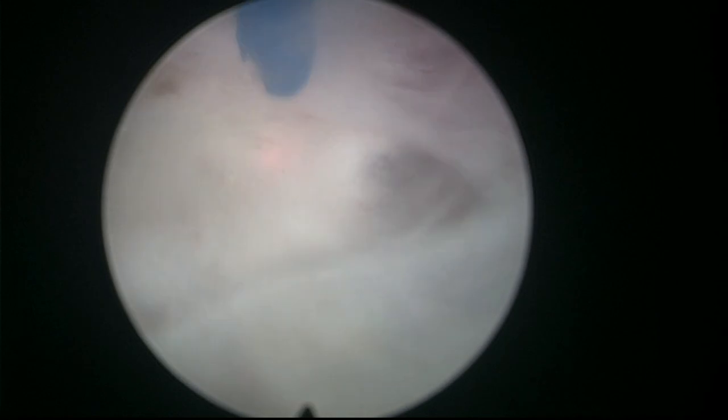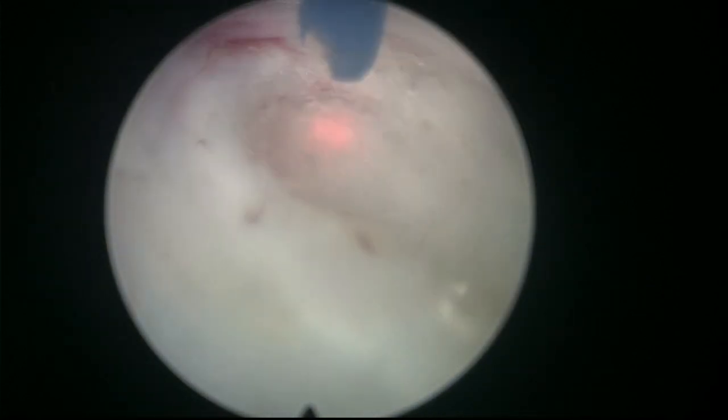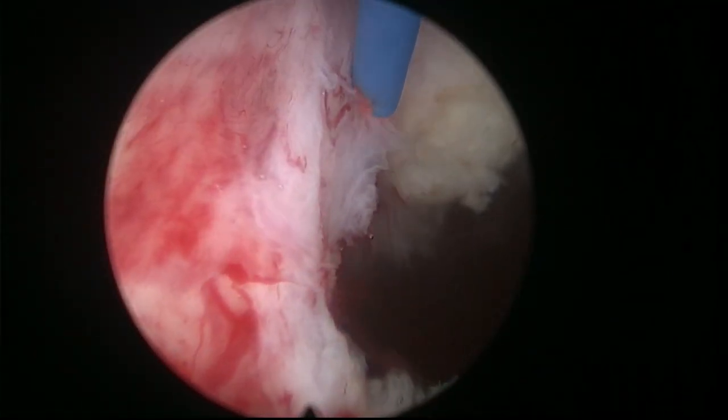As always, we split the screen in two parts. In the middle we have the line of attack. In the upper part we can see the prostatic adenoma. In the lower part we can see the capsule. The fiber goes in about a third of the screen maybe. And this is my favorite working situation. I put the fiber at 12 o'clock because I think it helps performing a very comfortable enucleation, and I keep it there for almost all the operation. I just did the original white line using the fiber at 6 o'clock because it's more difficult to go up there with the fiber at 12 o'clock.